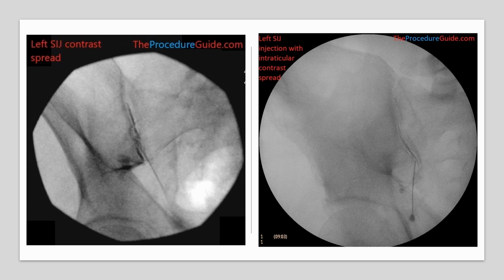A popular technique involves targeting the lower one-third of the bony sacroiliac joint. This method may appear straightforward, but there are several disadvantages. For instance, the clear, double line of the joint often seen on scans is usually deceptive. Thus, you typically first make contact with the bone, then move the needle around for some time.